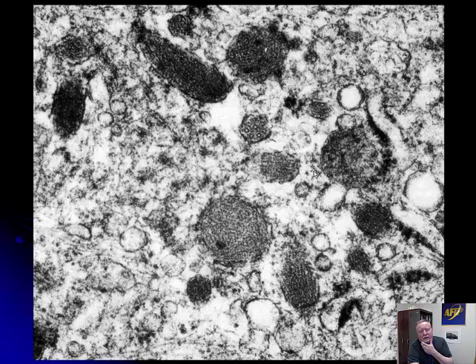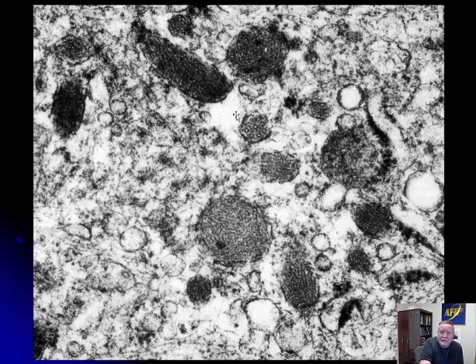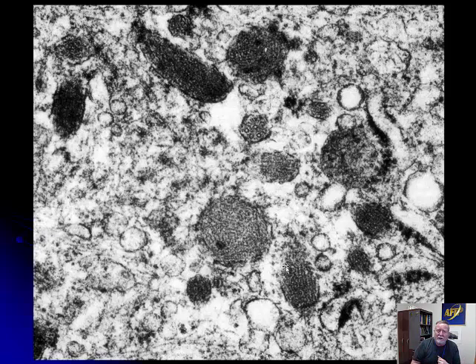A couple of other things as we look at blood vessels. If you look at endothelial cells very closely, you'll see structures that look a little bit like multivesiculate bodies with an intricate scrollwork. These are the Weibel-Palade bodies, which are the concentrating sites for factor VIII-related antigen in endothelial cells. Endothelial cells are sort of boring — they don't have a lot of organelles, they usually form a very thin lining on the inside of a vessel, and if you see a nucleus, that's a good day.